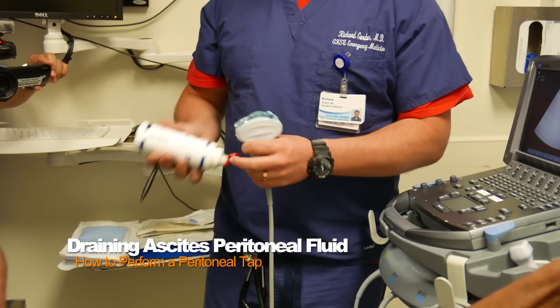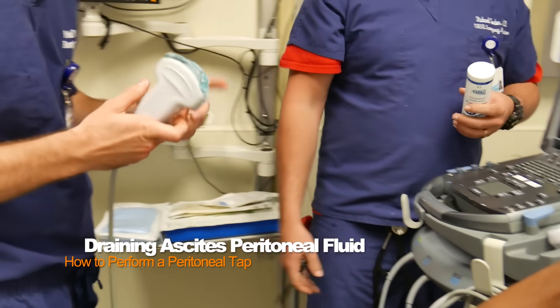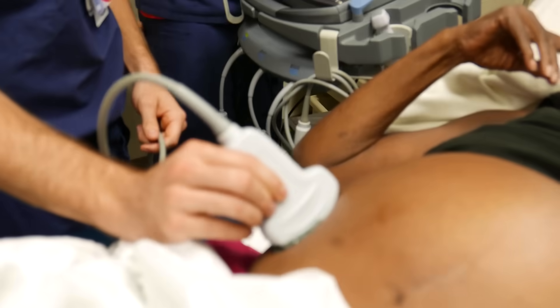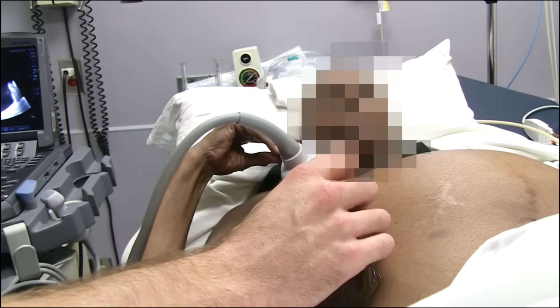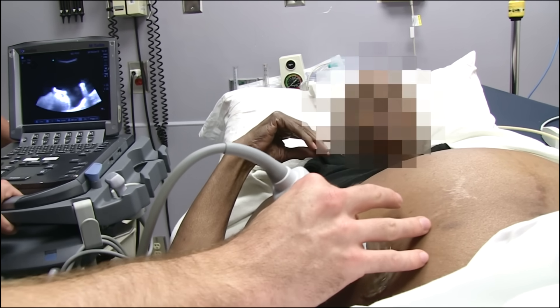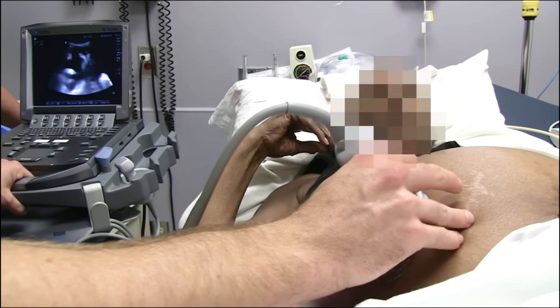We're not doing sterile because we're just doing a pre-scan. Go ahead and first place the ultrasound probe in a sagittal cut. Remember that the fluid is going to be dependent, so we're going to want to try to place the needle in a dependent location. You're more anterior currently, so we want to find a location where there's a pocket of fluid.